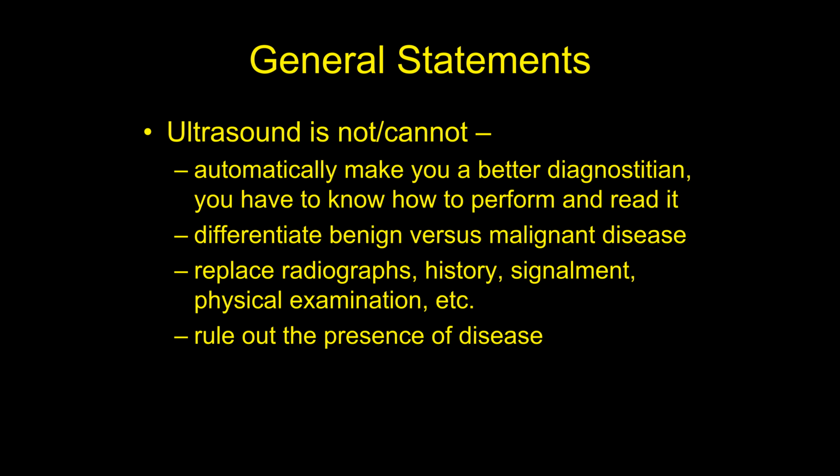It's not going to replace common sense things. It's not going to replace getting a history, talking to the owner, doing a physical exam, putting everything in context with the breed and the signalment of a dog and things like that. Okay. And again, we talked about a minute ago with mast cell disease in the liver, just because the liver may look normal doesn't mean it is. Okay, it looks sonographically normal, but there are some diseases that can happen in the liver and the spleen or whatever organ that don't cause it to appear abnormal on ultrasound. So it's not bulletproof.